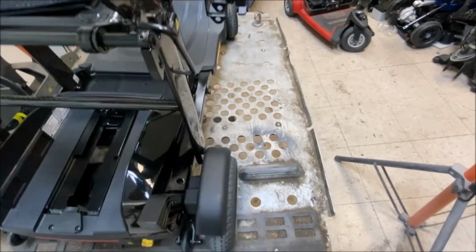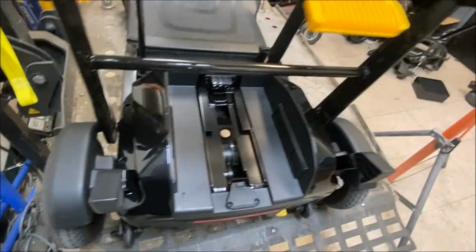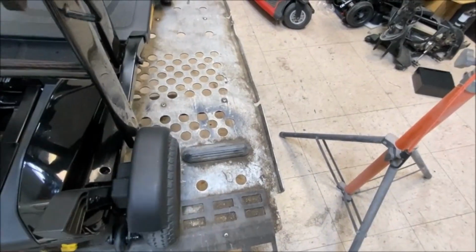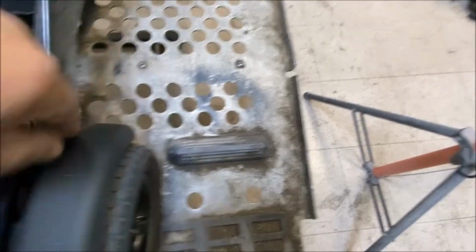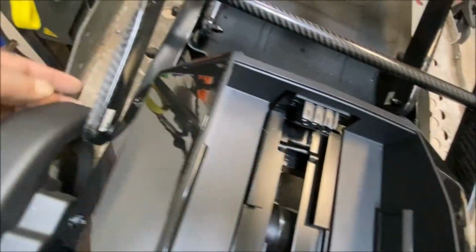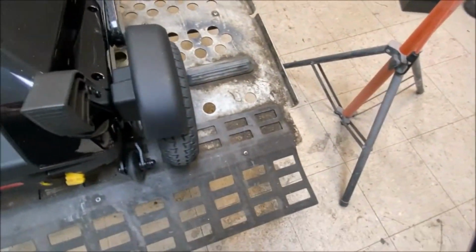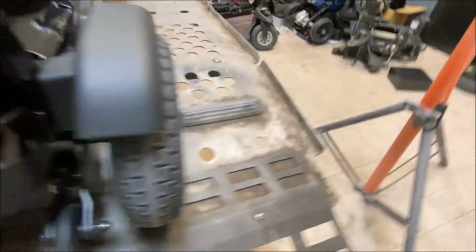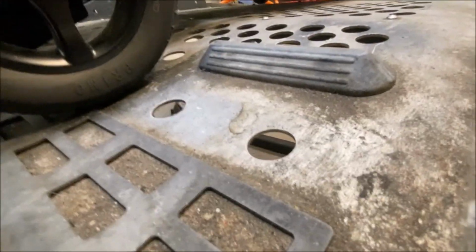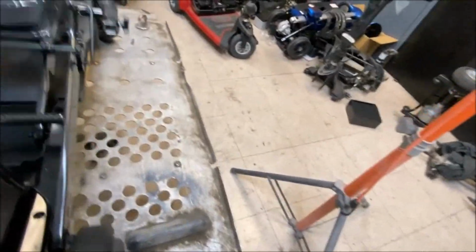Maybe. No, I don't. I can just remove the bottom 2 bolts, but I will have to remove the fender liners to get to them, because they're covered. They're covered, one there, one there. So you need to remove those to get access to it. I'm hoping I may not have to remove the wheel. It looks like I have to remove the wheels to get access to them. But, let's fold it down and see.